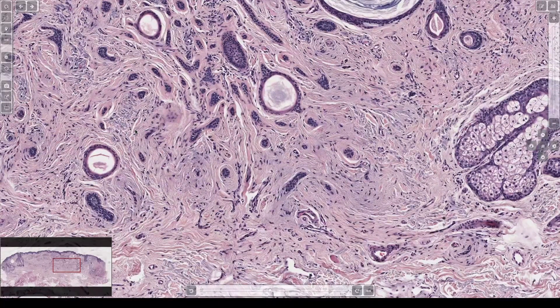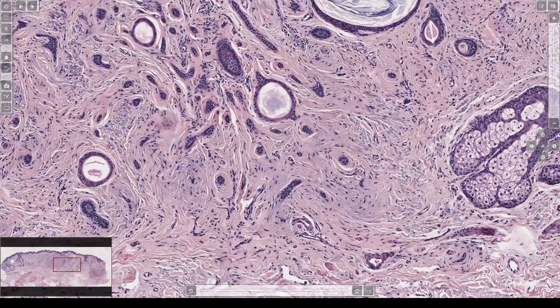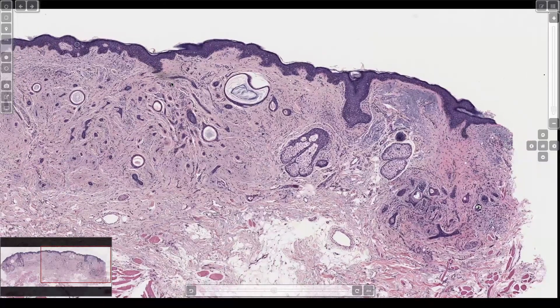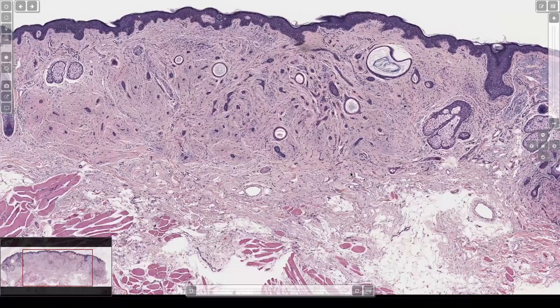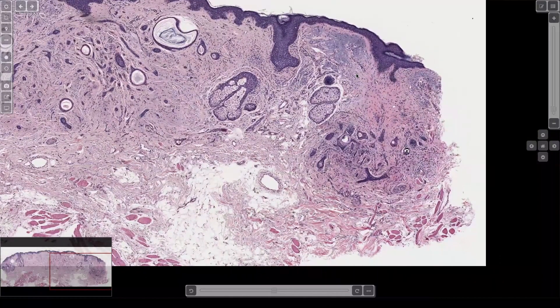MAC eventually shows tubules, but in practice it's hard to appreciate, partly because entrapped sweat ducts can mimic tubules. Various stains have been described — like cytokeratin 20, which stains scattered Merkel cells in desmoplastic trichoepithelioma and other follicular tumors but not in MAC or basal cell. I've found it occasionally useful, but on a small biopsy, no matter how many stains I do, I still hedge and recommend re-excision. The fact that so many stains have been described to sort this out tells you none of them work perfectly. A big enough sample and H&E is what I really need. This is a good example of desmoplastic trichoepithelioma — the tumor is limited to the dermis.